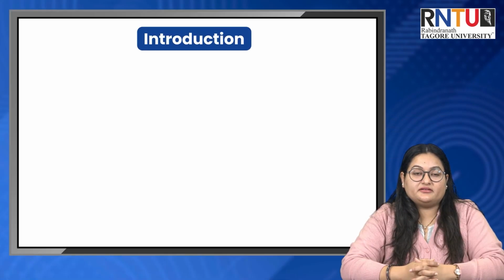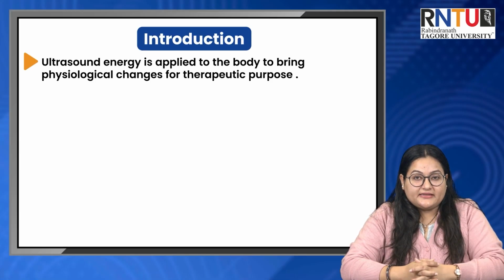Physiotherapy plays a crucial role in rehabilitation, and ultrasound therapy emerges as a non-invasive technique to enhance recovery. Ultrasound waves penetrate tissues, creating thermal and non-thermal effects. Let's understand the foundational principles behind this therapy. So let's get started. Ultrasound energy is applied to bring physiological changes for therapeutic purpose.